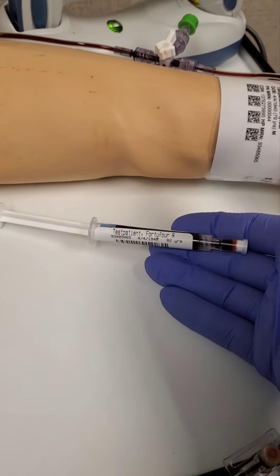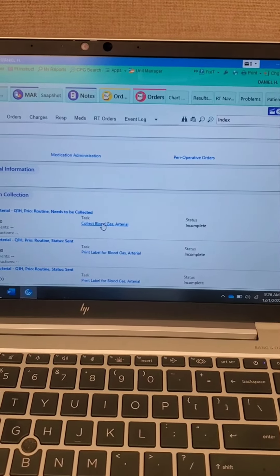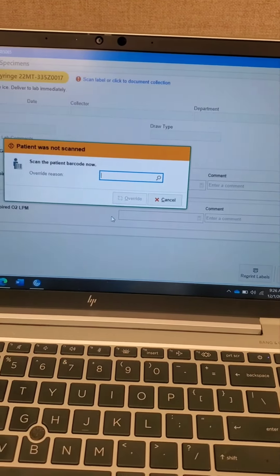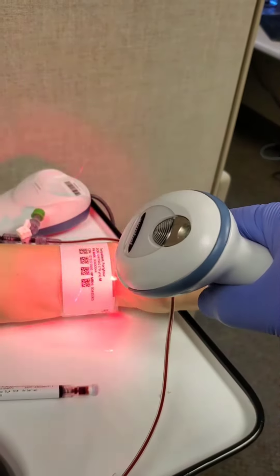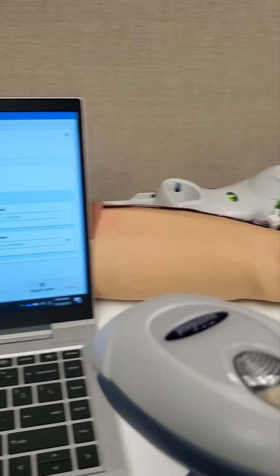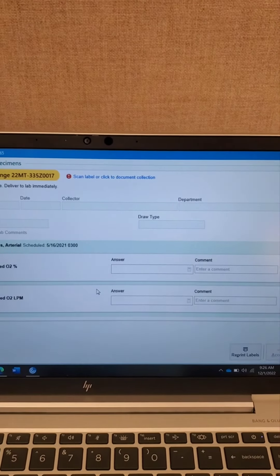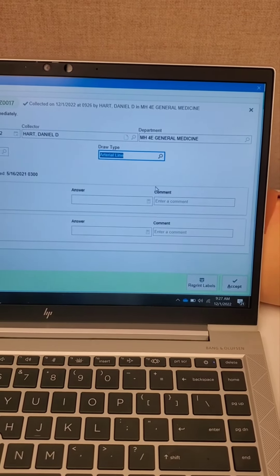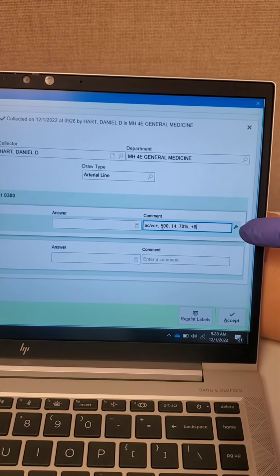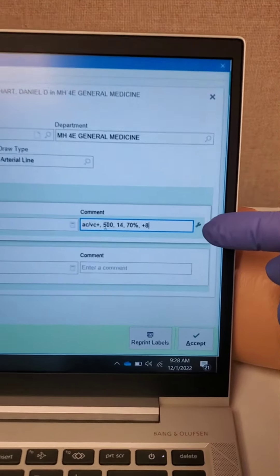Place the patient label on the syringe and proceed to collect the ABG in EPIC. Scan the patient wristband and then scan the label on the ABG syringe. Document draw type — this was an A-line.